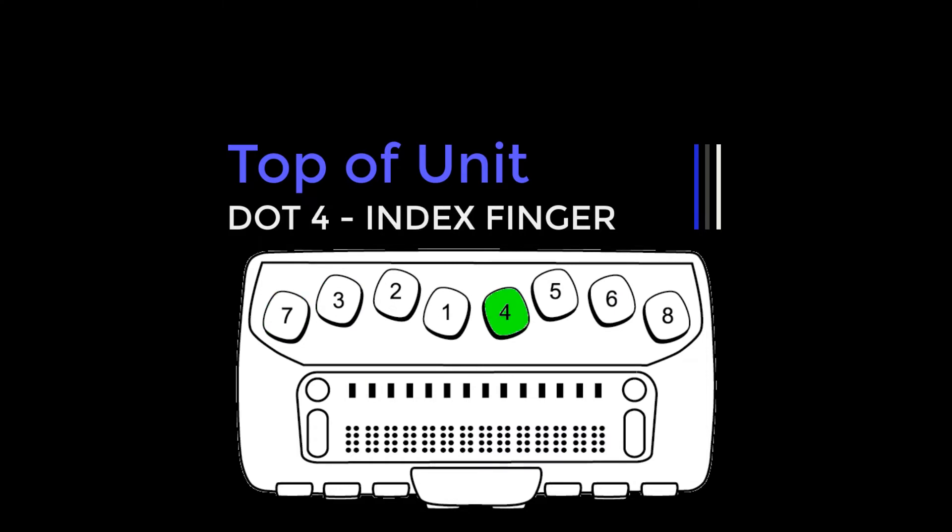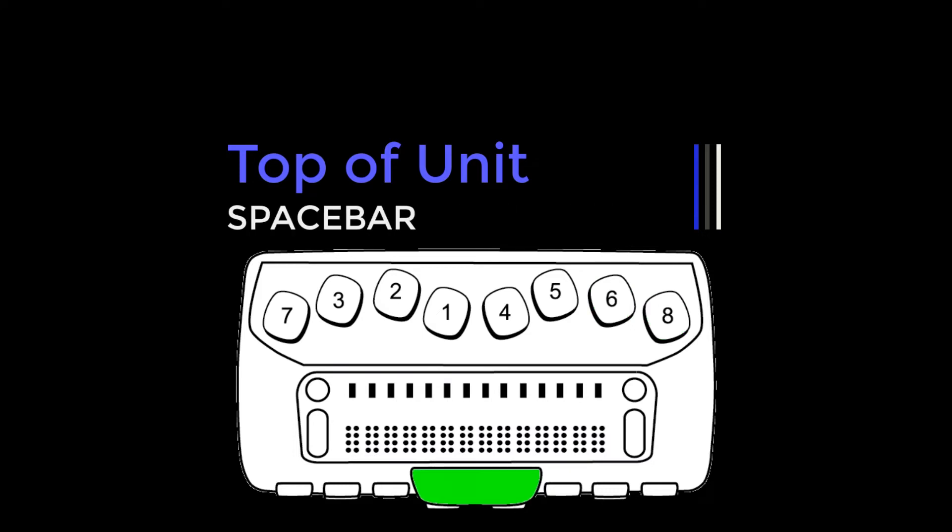Center to right with the right hand: dot 4 under the index finger, dot 5 under the middle finger, dot 6 under the ring finger, and dot 8 under the little finger. On the front edge, directly under and in the center of the display is the space bar.